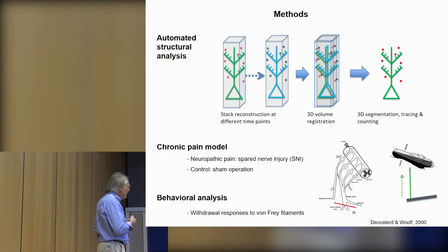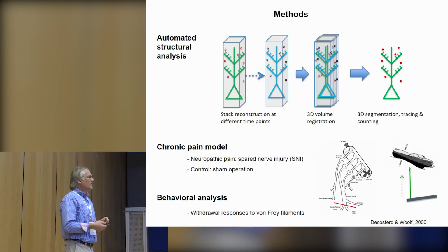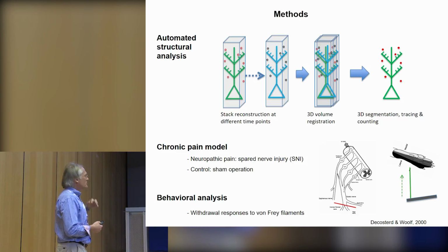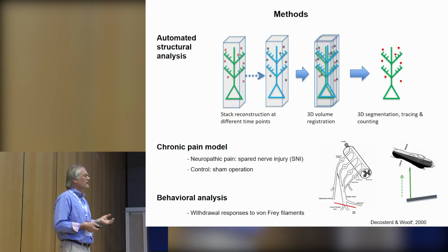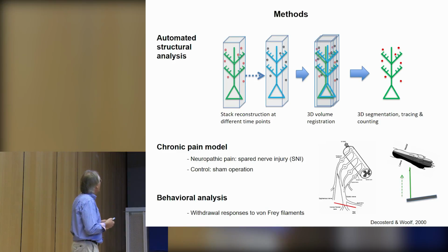So our goal here is not to do some kind of stereological or statistical analysis in terms of looking at small dendritic segments, but our goal is to study entire neurons. So again, we have the sparse labeling technique where we have only individual neurons sitting in a certain imaging volume, and we image the entire full neuron, as you will see. And then, of course, analysis is really the key in this project. I mean, we spent now 2.5 years developing an automated workflow, and I think it's now actually working. So we can now put in a cell and we get the tracing result out. So you have to basically first crop these stacks, then align them at different time points, do this 3D volume registration, then segment the data, and then compare the different time points in that imaging experiment.